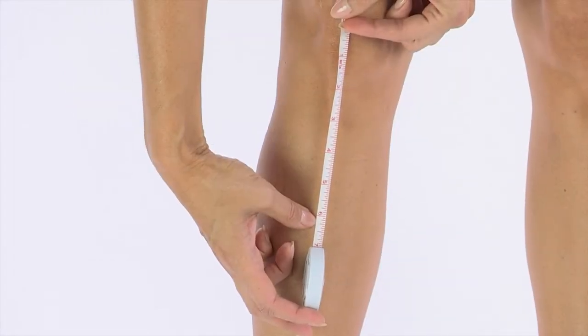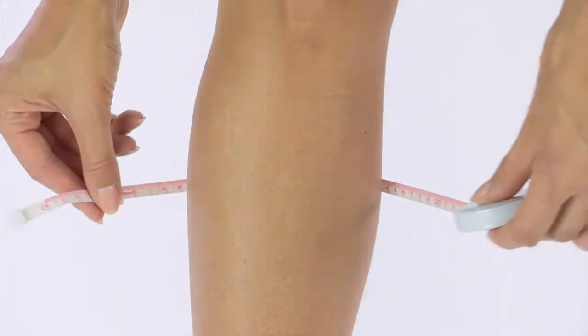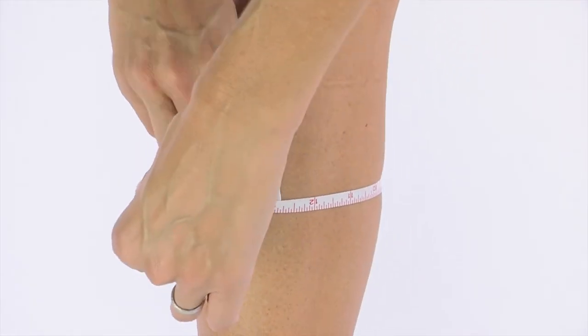And finally, measure 6 inches down from the center of your kneecap. At the 6-inch mark, measure the circumference of your calf.